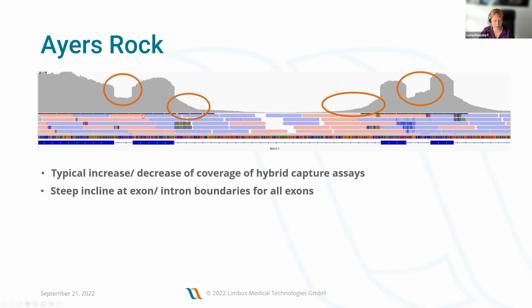So underlying, where there's no exon, you have normal coverage like you would. So normally the curve would be going like this somewhere, or like this, depending on where the probes are. But there are also reads that were aligning to the pseudogenes only at the exon, and those are basically on top. And since they were spliced, they start immediately with the exon-intron boundaries.